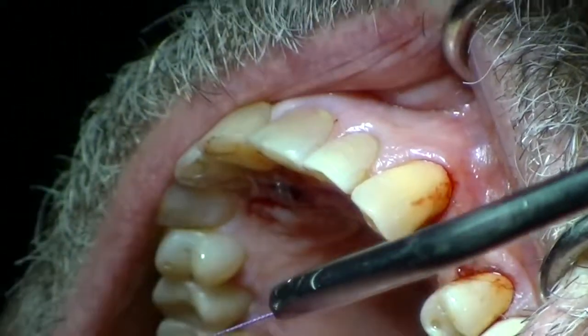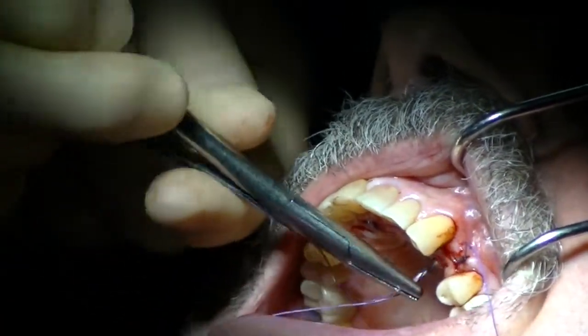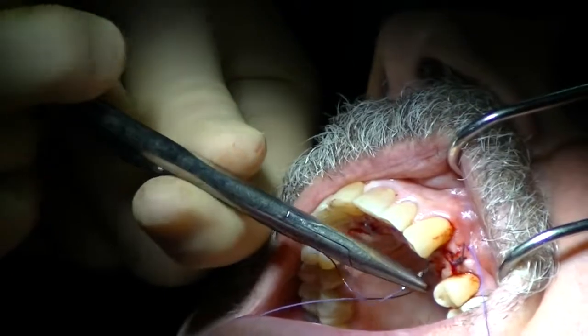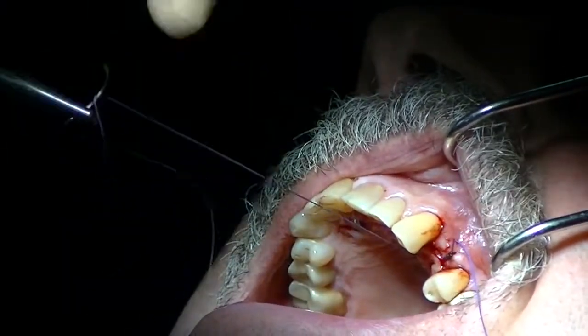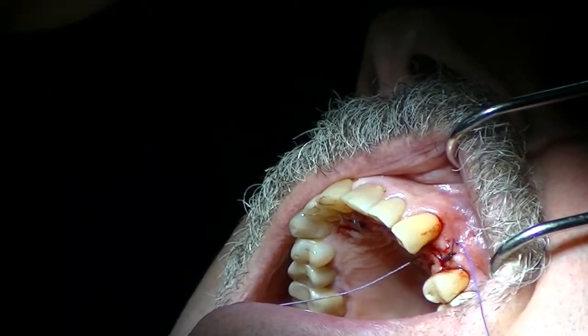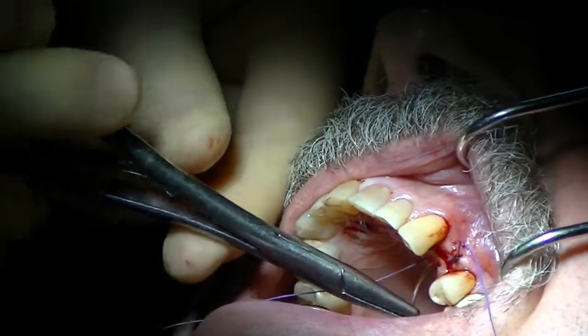So I'm not exactly sure how long this procedure took, and obviously we didn't stop to take a lot of radiographs just to expedite the procedure, but it certainly was no more than a 20-minute procedure for the patient.